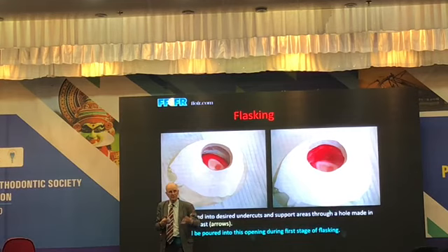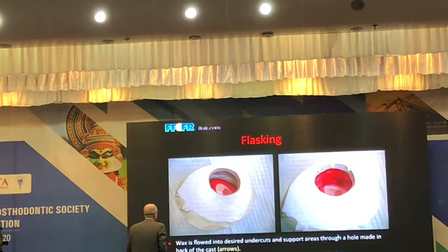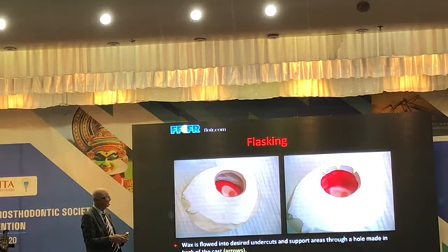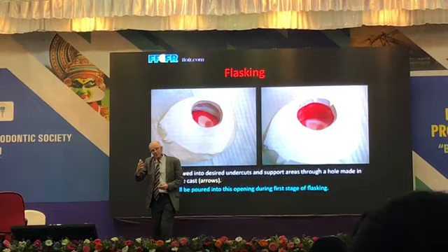So look at the difference between left screen and right screen. I've drawn a line here on where I want the wax to be flowed, and I want a very thin layer of wax here, about a millimeter and a half, but that is very flexible. That area will engage the undercut or other surfaces in the defect and help retain the appliance in place. We're actually looking at the floor of the orbit here. You can't really see it, but the cast is kind of upside down.